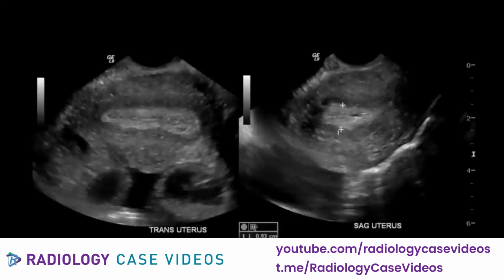So this is the uterus with no obvious uterine anomaly. The endometrial thickness is within normal limits. There's mild pelvic fluid in the pouch of Douglas.